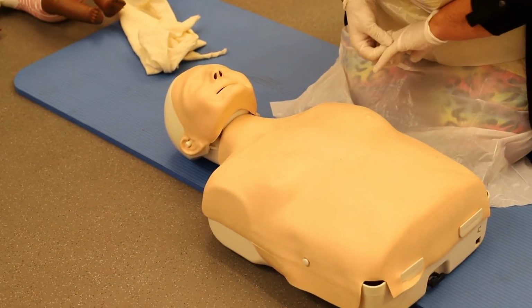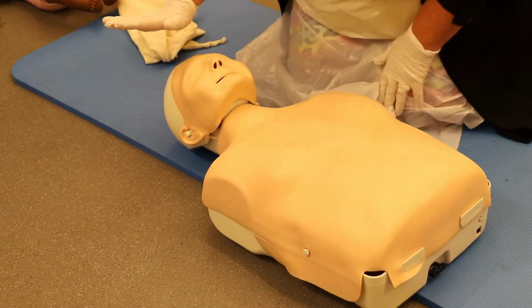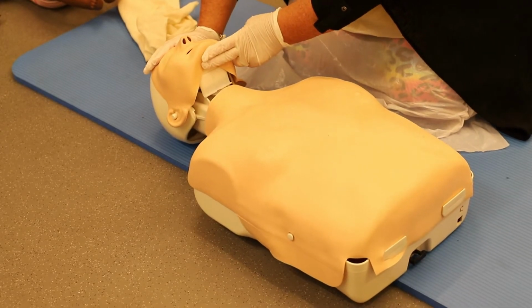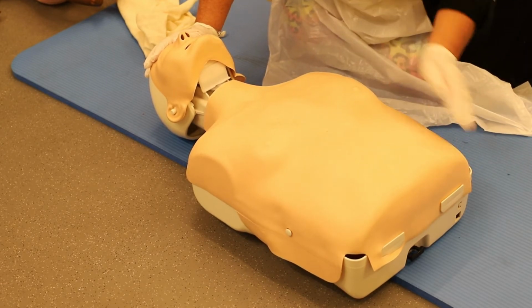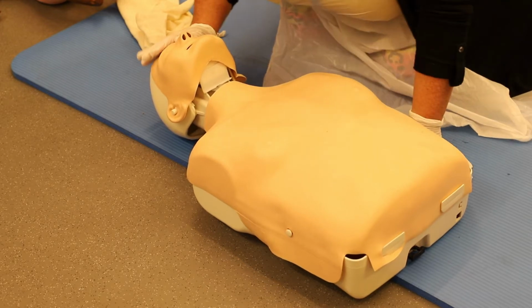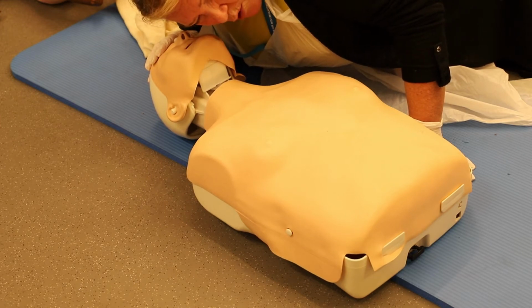However, we've got no response from our casualty, so now I need to open the airway. We do this by putting our hand on the forehead and 2 fingers underneath the chin, and we tilt the head backwards. Okay. And then what we're doing is looking and listening for 10 seconds to see if we can see the chest rising up and down, and to see if we can hear breath in our ear or feel breath on our face. We're doing that for 10 seconds. 1, 2, 3, 4, 5, 6, 7, 8, 9, 10.